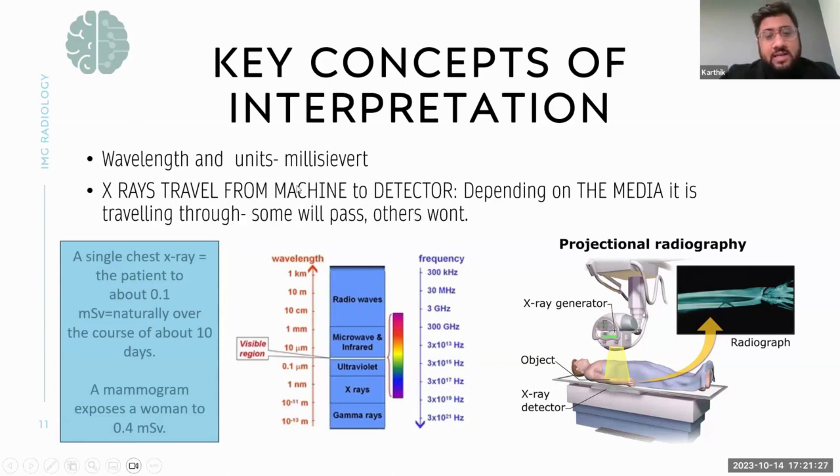X-rays travel from machine to detector depending on the media they're traveling through. Some will pass and some won't.